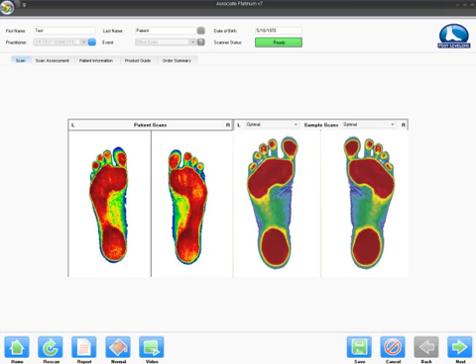The next area will be weight distribution. Explain that you want to see a 50-50 split, with 50% at the calcaneus in a centered pattern, and the remaining 50% in the metatarsal area and toes, and nowhere in between.